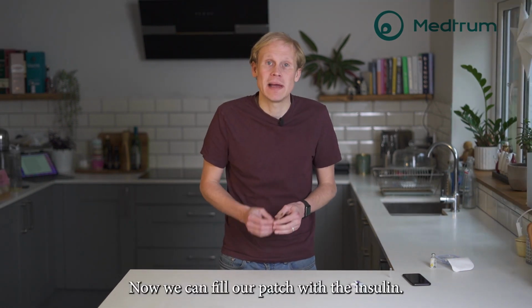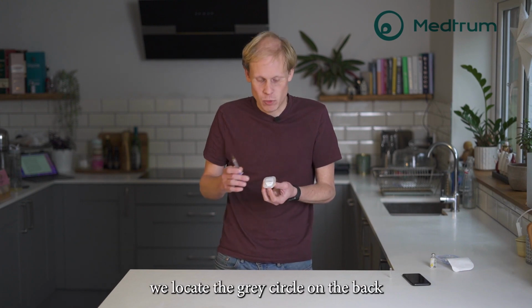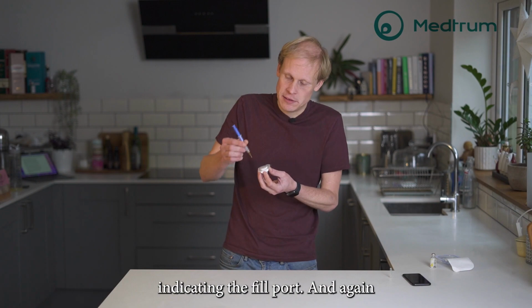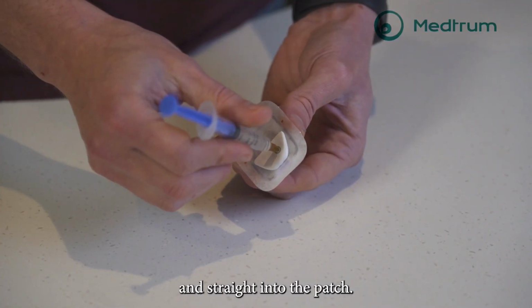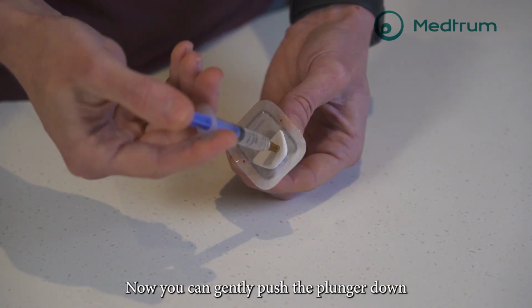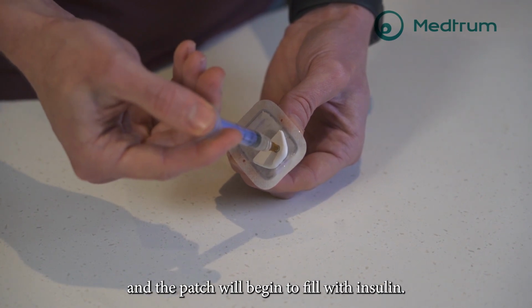Now we can fill our patch with the insulin. So we pick our patch back up, we locate the grey circle on the back indicating the fill port, and again we put our needle in perpendicularly, nice and straight into the patch. Now you can gently push the plunger down and the patch will begin to fill with insulin.